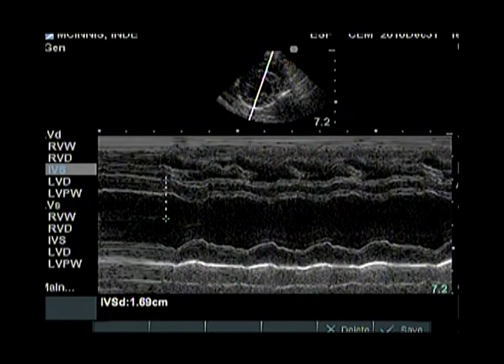Do not include right ventricular papillary muscle in the septal measurement. If papillary muscle is present, try to identify and follow the most persistent hyperechoic line of the endocardium to the point you choose to measure. This is followed by a measurement of the left ventricular chamber at its widest point, close to the next muscular contraction.